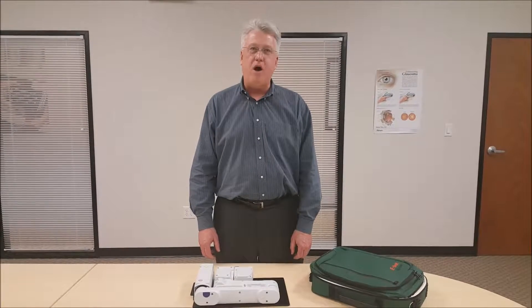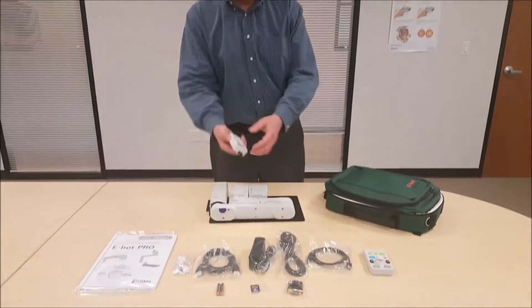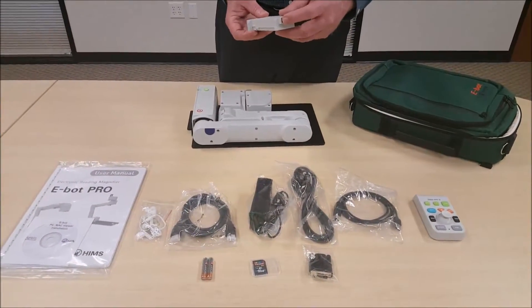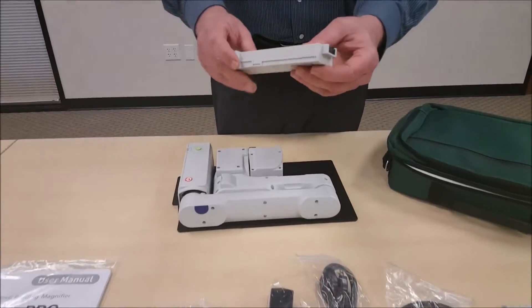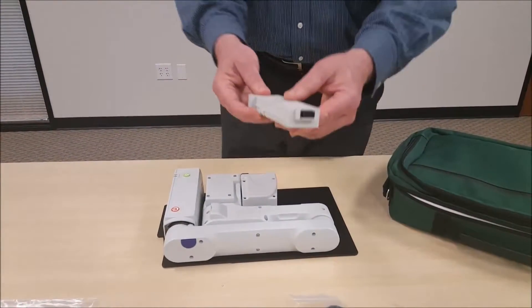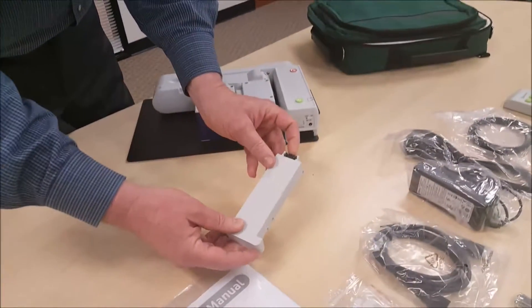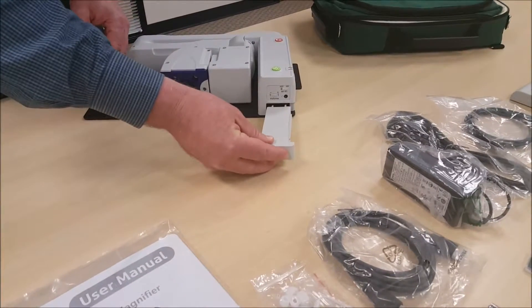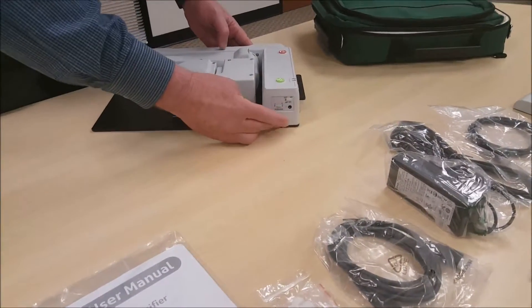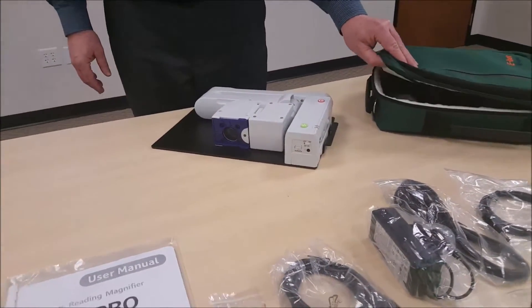We're going to put the E-Bot back into the backpack. The first thing to do is grab the battery. At one end it has a black connection, and the other end has a hook on it. We're going to have the black part up on the end going in first, and slide it into the E-Bot unit until it clicks and the battery is in.